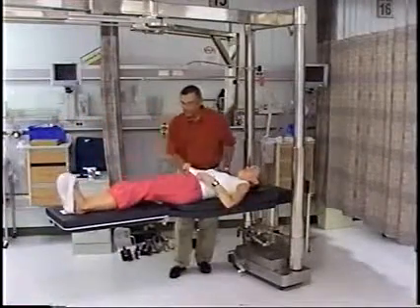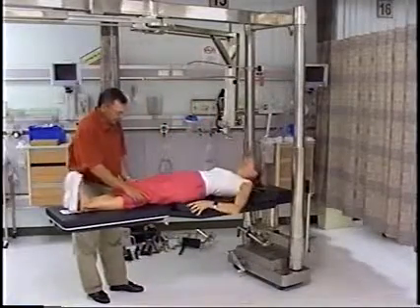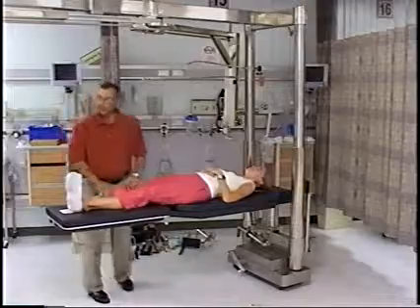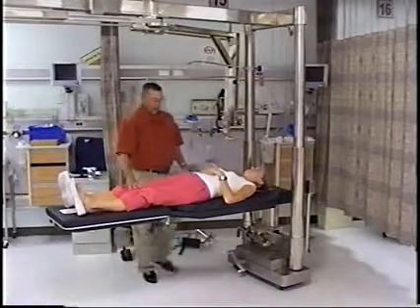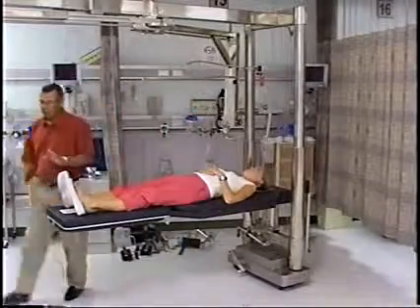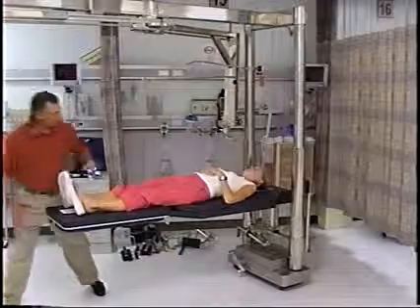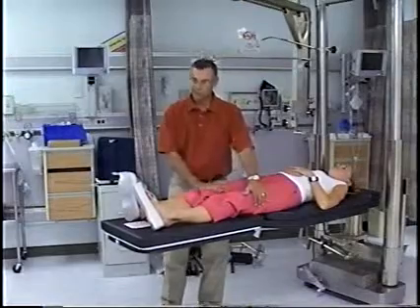Once she's intubated, that's great. You can back up just a little bit. Once she's intubated, then we're going to set up the table for our right hip. Remember, we said we have to have traction, we have to have counter traction, and we have to have a place for the well leg. This is the part I like most, right here.